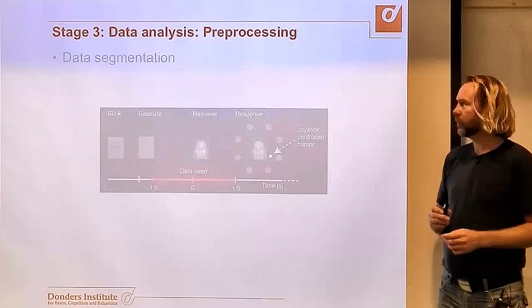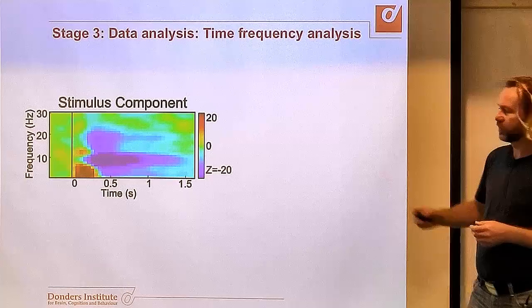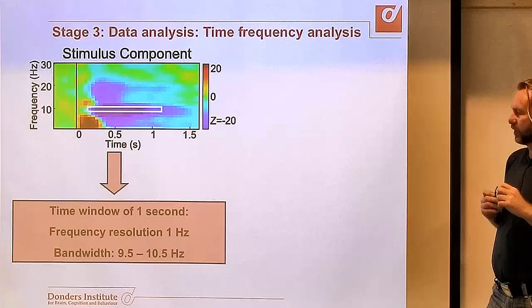And then we do the pre-processing, we segment the data, we remove the artifacts, we do the time frequency analysis, so we look at what's happening after stimulus onset, and then we select a time frequency window, and then we say, let's beam this tile, this time frequency window. So there's a stimulus component in here as well.